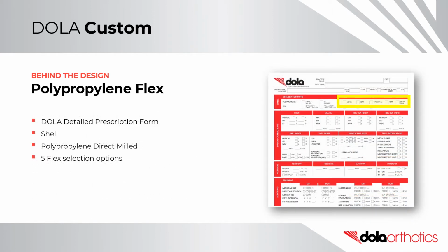They were able to select from 5 options for polypropylene flex from the shell material options in the detailed scripting section of the DOLA Custom prescription form. Selecting the same flex for each pair ensured consistent results.